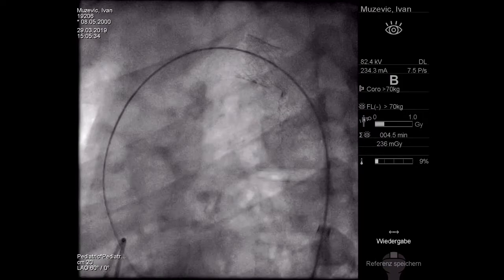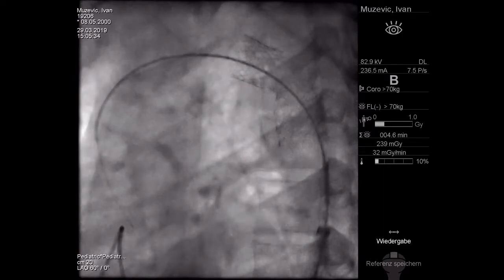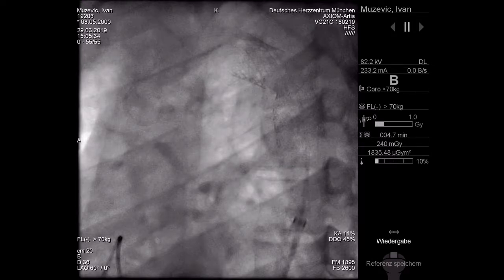So maybe helpful, Peter, to explain when do you use this asymmetric mounting on a stent, and in what special situation you use that. Yeah, right. Honestly, this asymmetric crimping is due to the fact that we do not have all the balloons available on the market in stock.